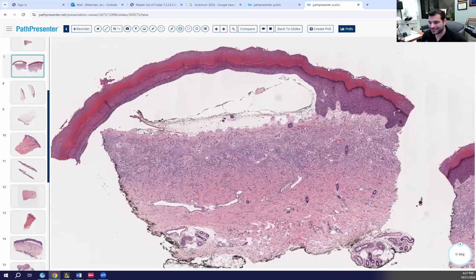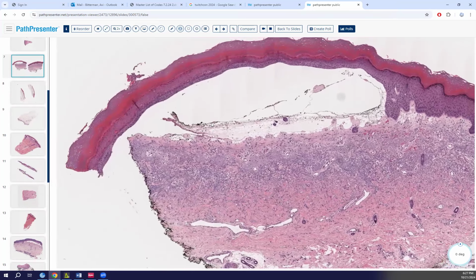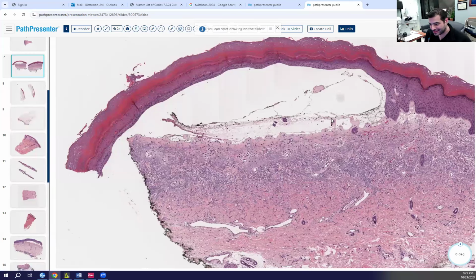What's happening here, guys? Bullous skin. What kind of bulla? Bullous skin and subepidermal split. Subepidermal. Good. Where are we, by the way? Volar. Volar bulla. Nice. There looks to be some festooning of the dermal papilla. Yeah, there's festooning.